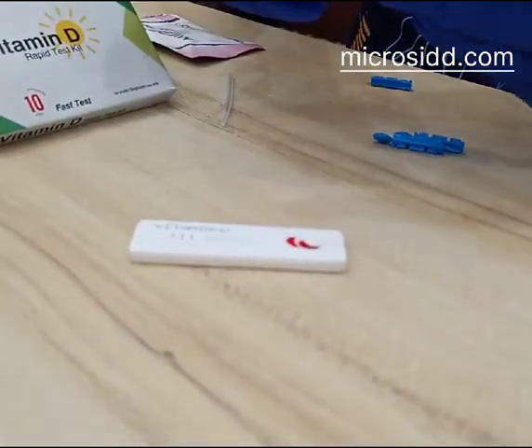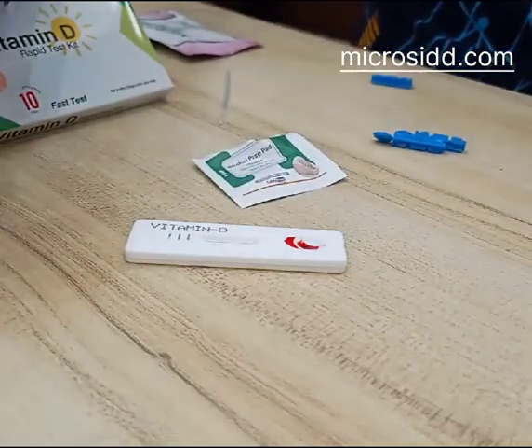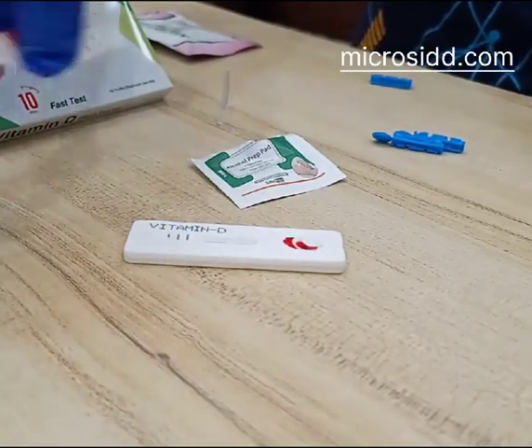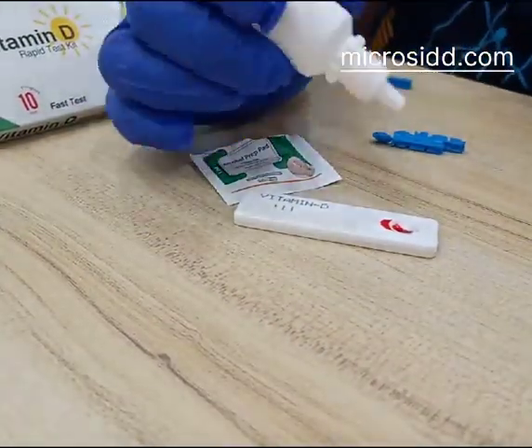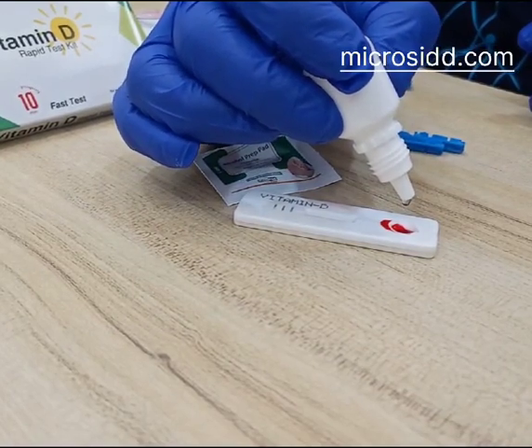Now take the swab and wipe off the lid to avoid any kind of contamination due to leakage. Now the sample has been applied — wipe off, then just push off two drops of buffer.